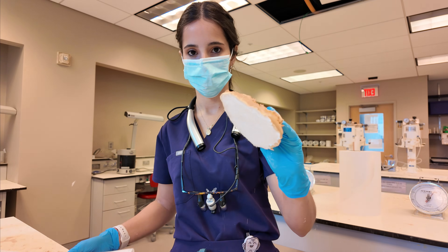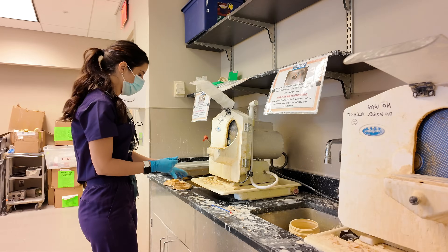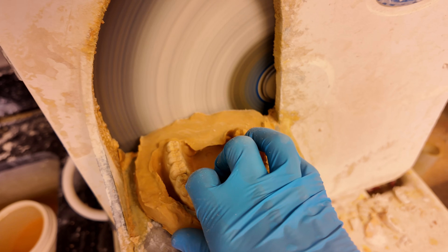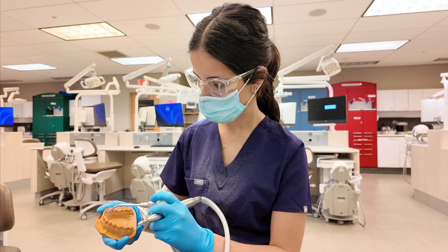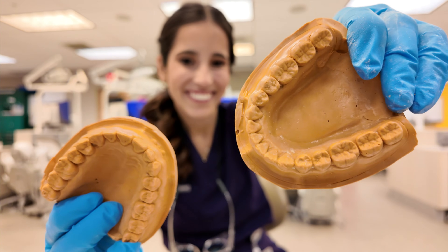After about 30 minutes, my cast was set and there were some bubbles when I took it off the impression, so I just nicked them off with a buffalo knife. Then it was time to trim. There's some extra material that I'm going to take off with a pineapple shaped burr. Those are my two casts, ready for Fixed Pros.